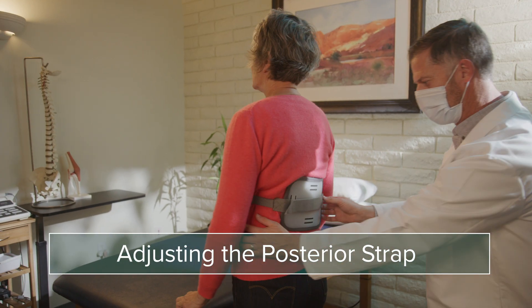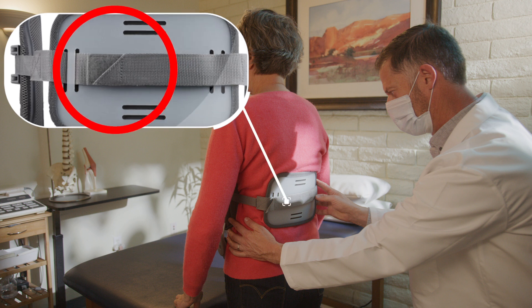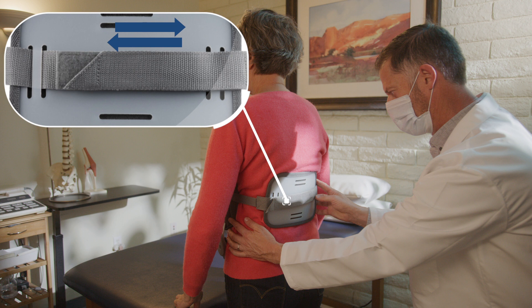To adjust the posterior strap, a clinician can remove the hook and loop. Adjust the length and reapply. Secure by pressing down on the strap.